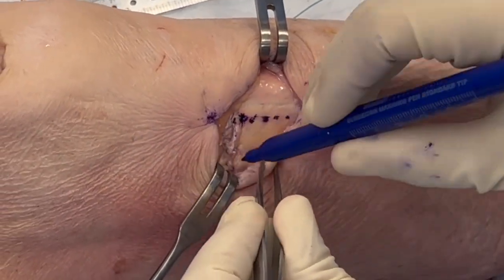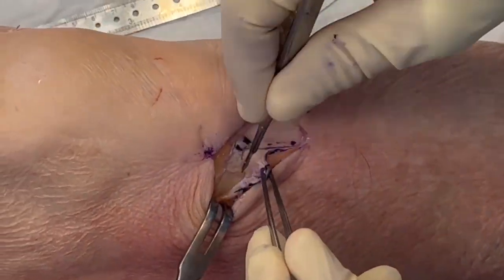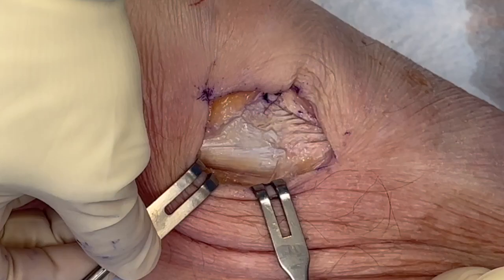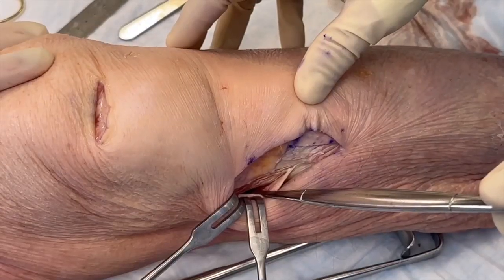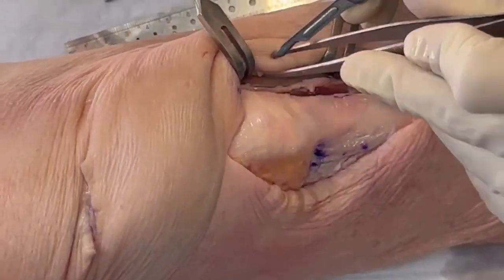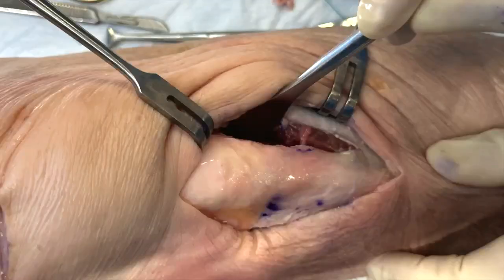We mixed videos from an actual clinical case with a cadaver lab. I mobilized the pes to expose the MCL and then I undermine the superficial MCL. Just want to mobilize it enough that you can bring retractors underneath. Once you have the medial side, then you switch over to the lateral side. This is very similar to a TTO approach where you take the muscles of the anterior compartment off the lateral tibia.